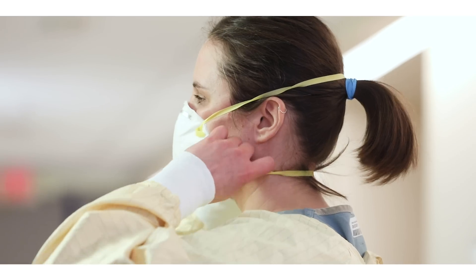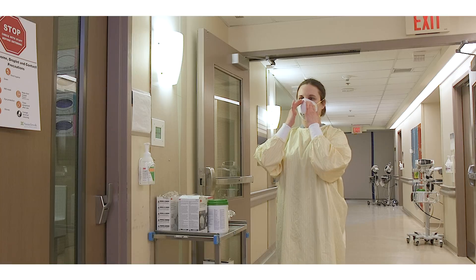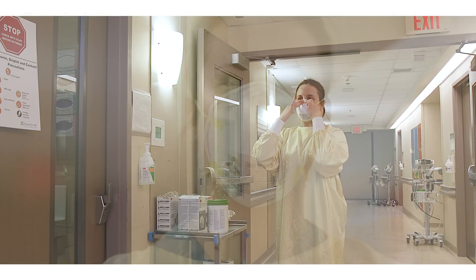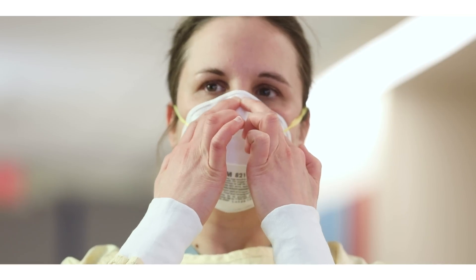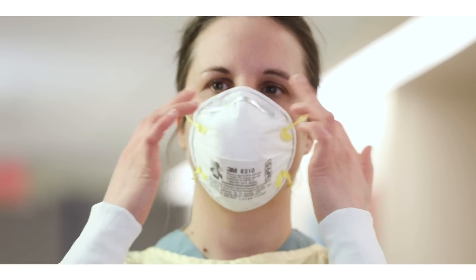Check if the mask is properly formed to your face. Ensure there are no folds by running fingers along the edges of the mask. Mould the metal nose strip to conform to the shape of your nose by placing both middle fingers at the bridge of your nose and using your index fingers to press along the edge of the mask from the sides of your nose into the cheeks, creating a good seal. Repeat pressing with your index fingers with pressure especially alongside the nose.